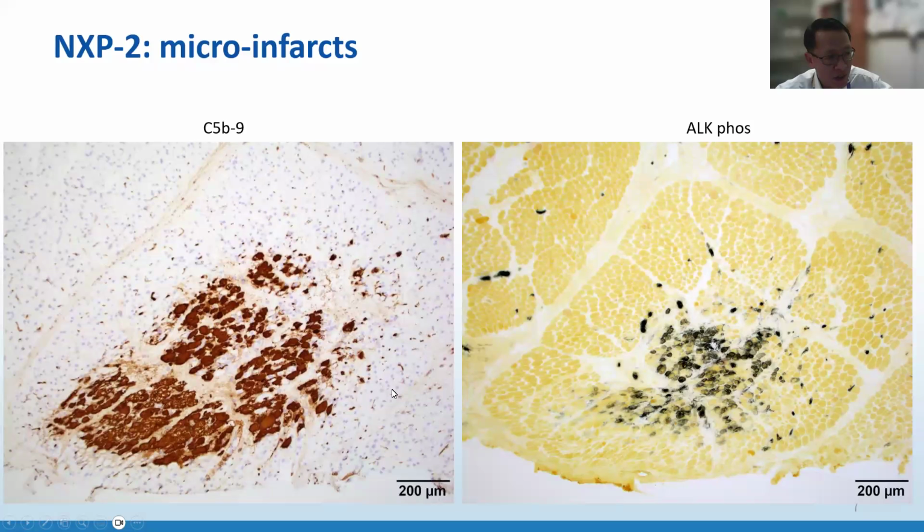And when the infarct happens, you can see that this is a very well circumscribed region, and there's confluent necrosis in this region. And it has a roughly round shape that corresponds to a vascular territory. And also note in the background, you can see this pretty robust capillary staining surrounding this area.